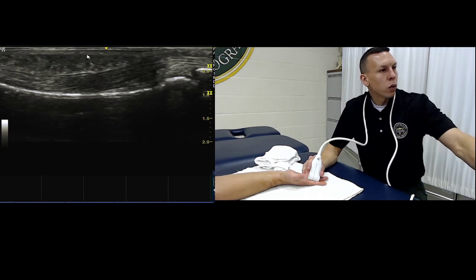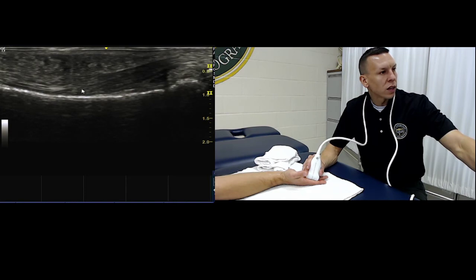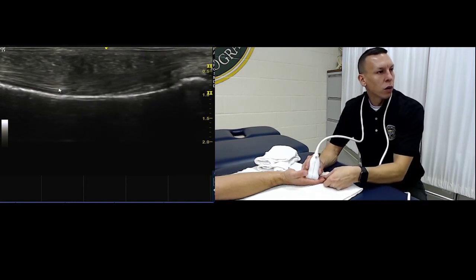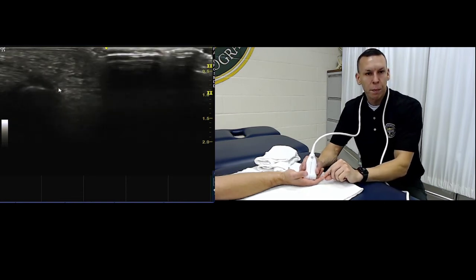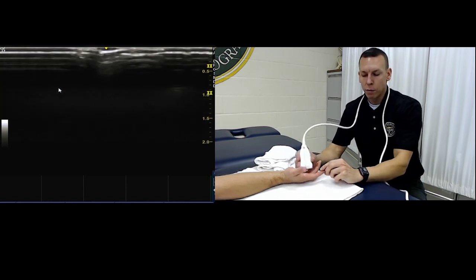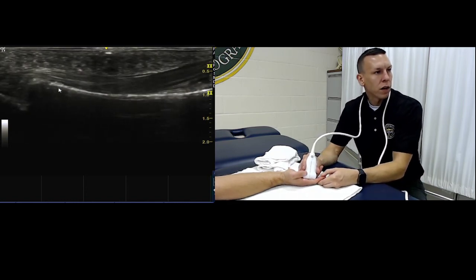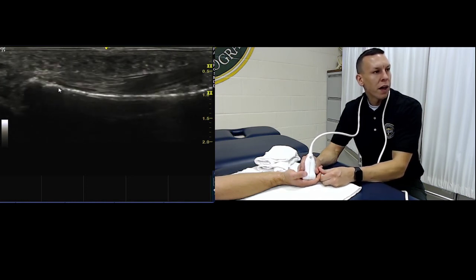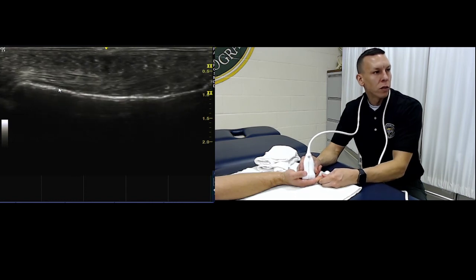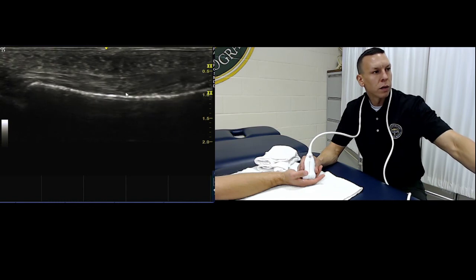When you're looking at pulleys, you can have a little swelling around the pulley, but what we should see is that the tendons are really close to the bone, and we're looking for any kind of bowstring. As you move there, I'm moving the pinky up and down, or I'll have them see if they can flex their pinky. If you can, go ahead and flex it. Yeah. So you should see it slide without bowstringing above the bone. It should stay real close to the bone right here.